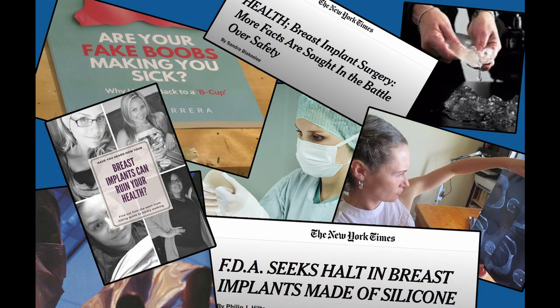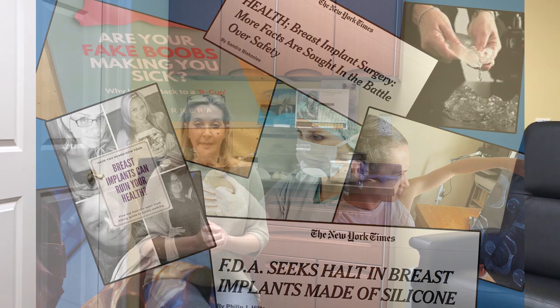Okay, so the first question is whether you're going to get a silicone or a saline implant. There was a lot of controversy back in the 90s about silicone implants when they were actually taken off the market because there were people who felt that they may be making them ill. They were the most extensively studied medical device that's been through FDA clearance and have been found to date to be completely safe, to the point where I have them myself. I would feel very comfortable putting them into my family, and we're talking about silicone gel implants. But still, the choice remains.